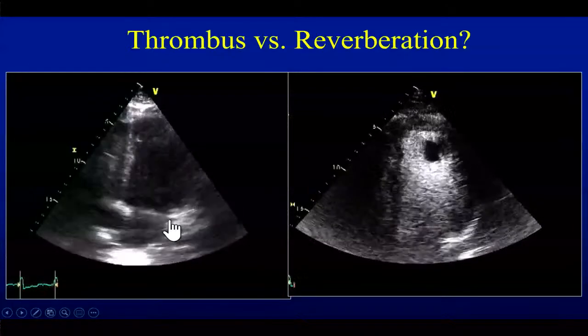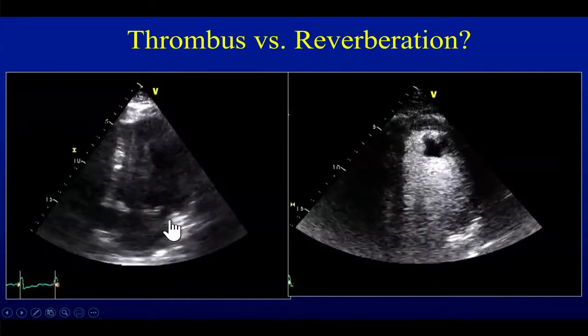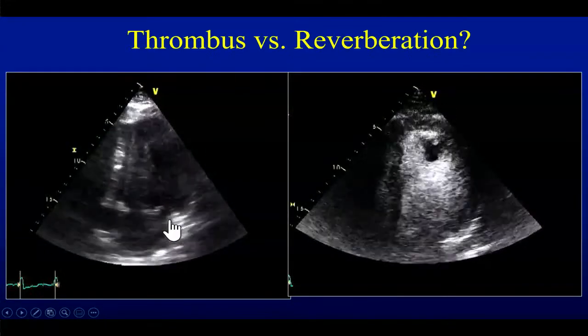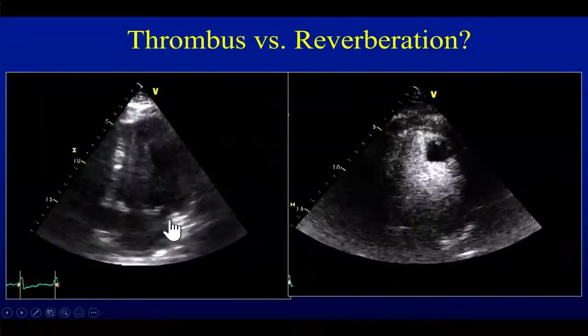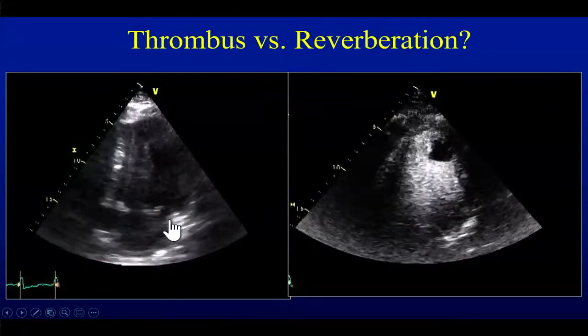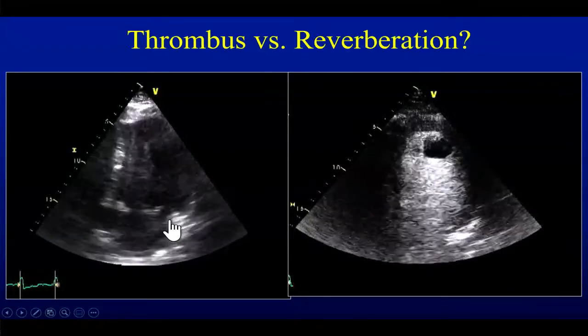It's amazing, isn't it? It really is amazing, what you could be missing if you don't have a good, pristine echocardiogram. So use your judgment, use your visualization, as to when to use contrast.